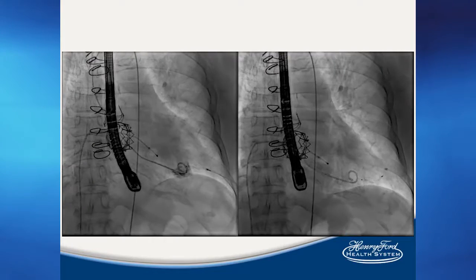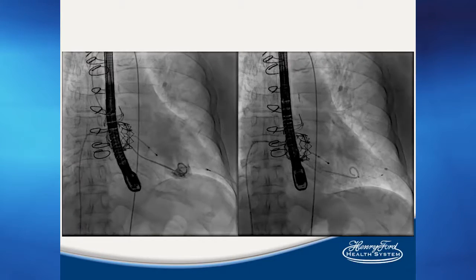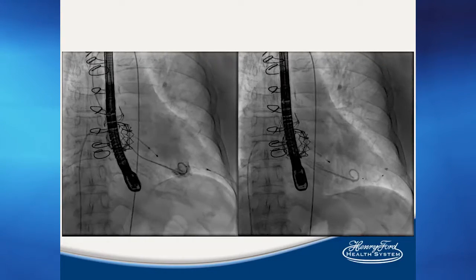And just in case you're interested, once we make the hole there, we do close it with this little nitinol device that's made by St. Jude Medical.